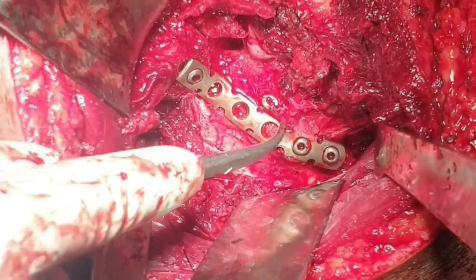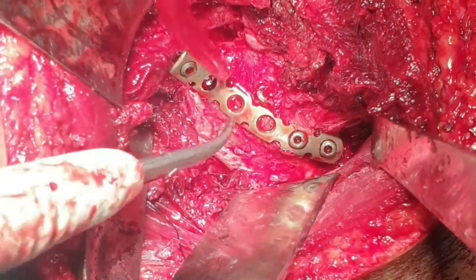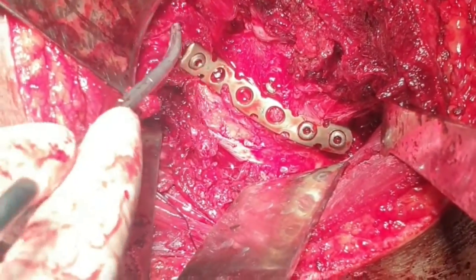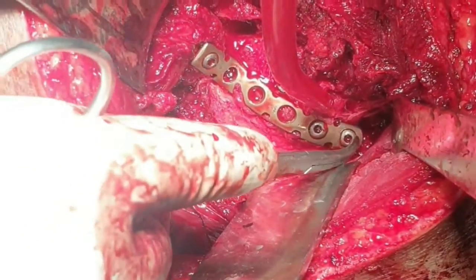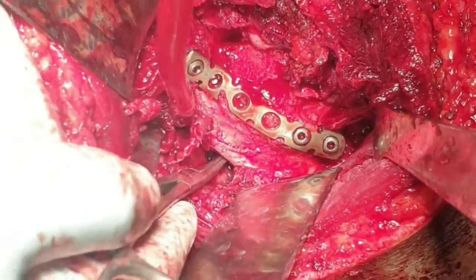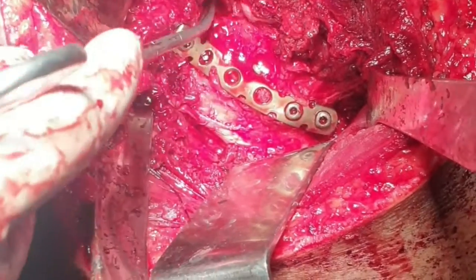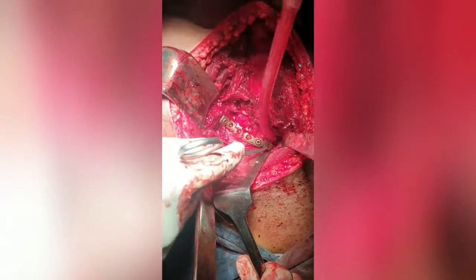So we have given a lag screw here. This is the lag screw, and this is the buttressing plate. So we have given one screw directly into the ischial tuberosity through the ischium, and two screws in the upper and cephalic corner of the acetabulum, and this is the greater sciatic notch, and this is the lesser sciatic notch. And so you can appreciate a nice reduction and stable fixation of the posterior wall.